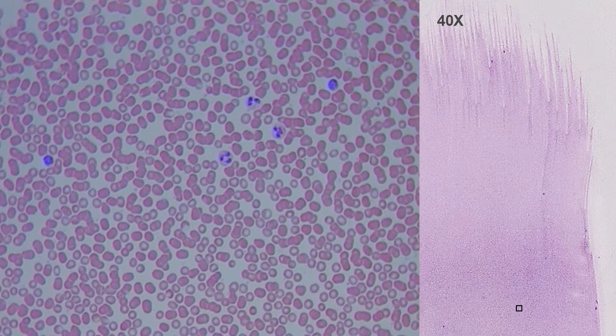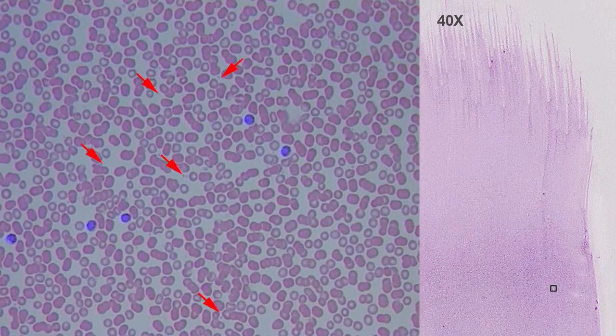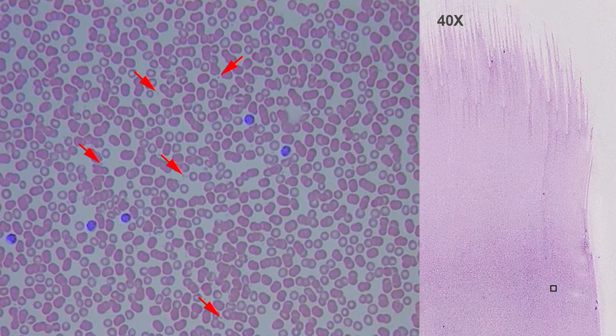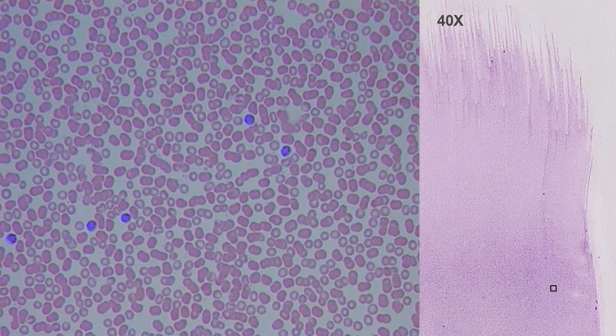Eosinophils and basophils are less frequent. Platelets can also be found, which are cytoplasmic fragments of the precursor cell, the megakaryocyte. They are actively involved in clotting and may be found isolated or clumped. They are infrequent in these samples because the smear was quickly drawn right after blood extraction.